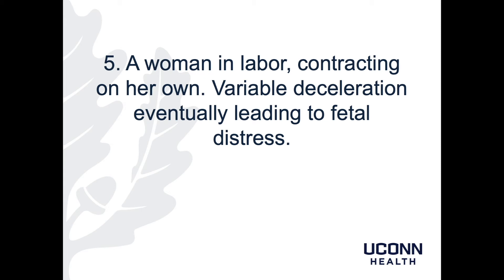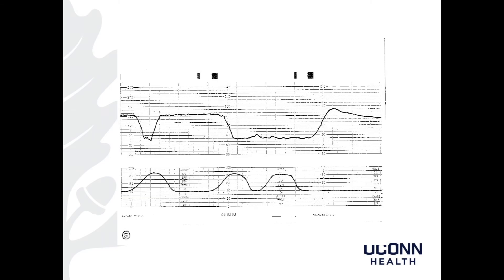Patient 5 is a woman in labor contracting on her own. There is a variable deceleration eventually leading to fetal distress. My read: baseline of 150s with minimal variability. There are no accelerations. There is a positive variable deceleration, followed by a prolonged deceleration. This is a Category 2 tracing. You can see that the prolonged deceleration goes down similar to a variable deceleration but lasts about 2.5 to 3 minutes — that's what makes it prolonged.